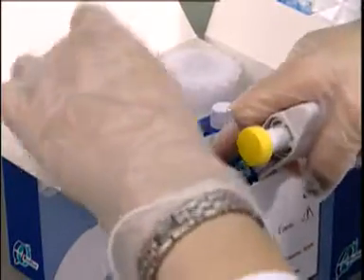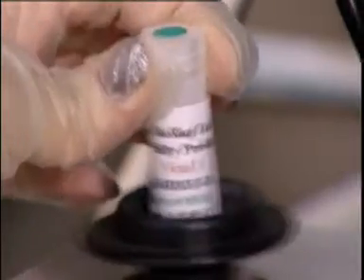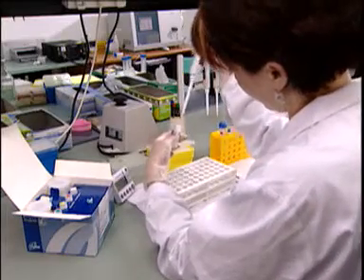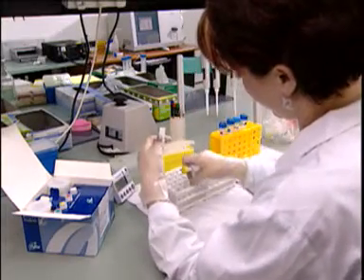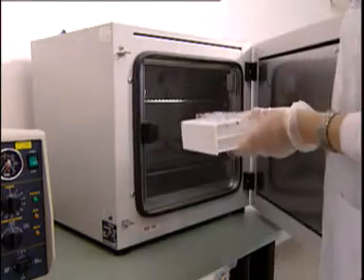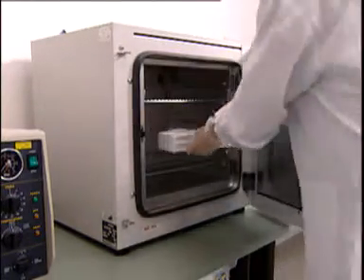Then several reagents are added to tube C. This mixture of reagents is able to rapidly induce the acrosome reaction. The cells are then incubated at 37 degrees Celsius for 30 minutes.